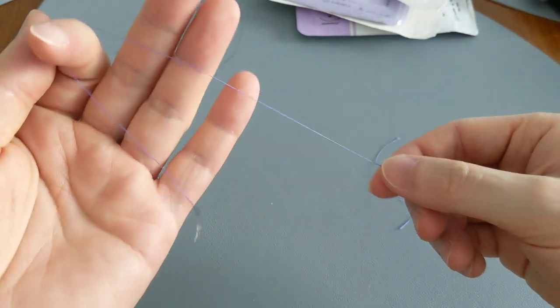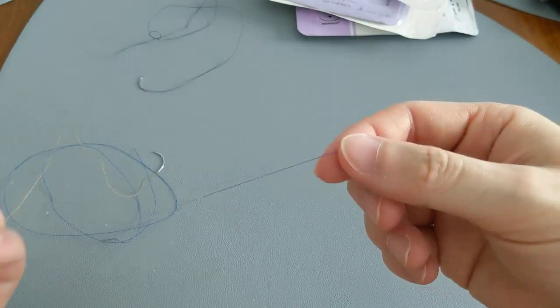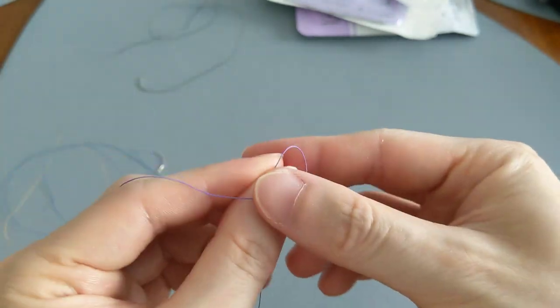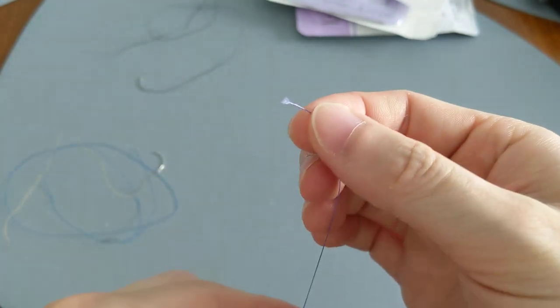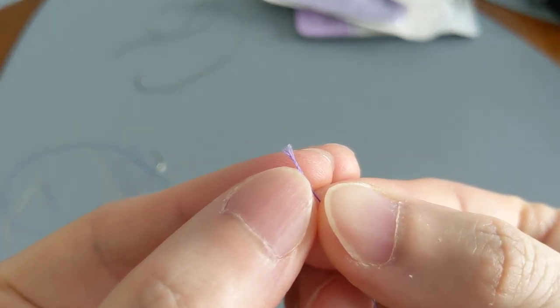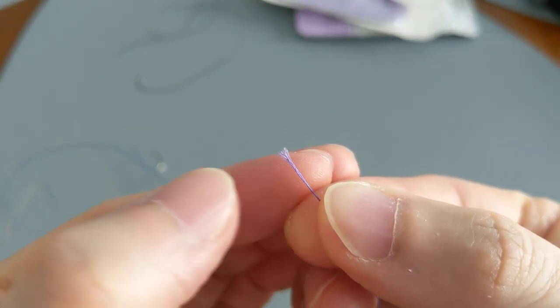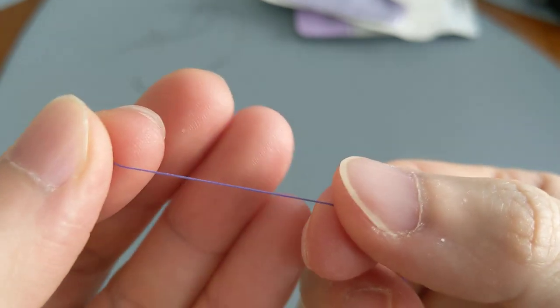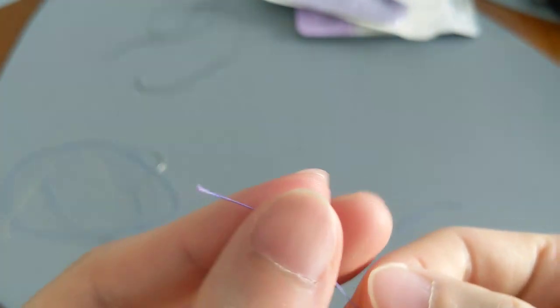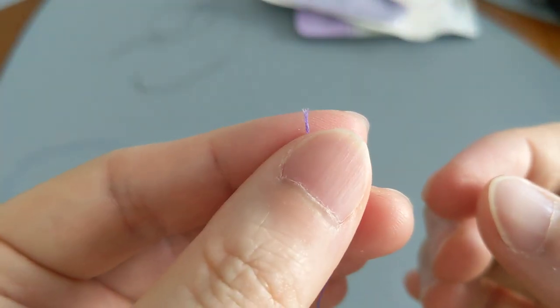So here we have a purple absorbable suture that dissolves on its own. If you go to the end of it sometimes, they can start fraying at the end. You can kind of see how it's coming apart in different strands. So you can tell it actually looks like one string, but it's actually multiple strings that are just intertwined into each other.